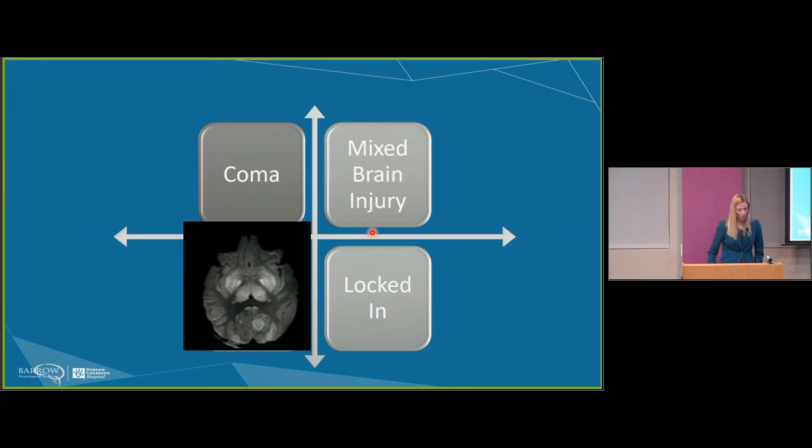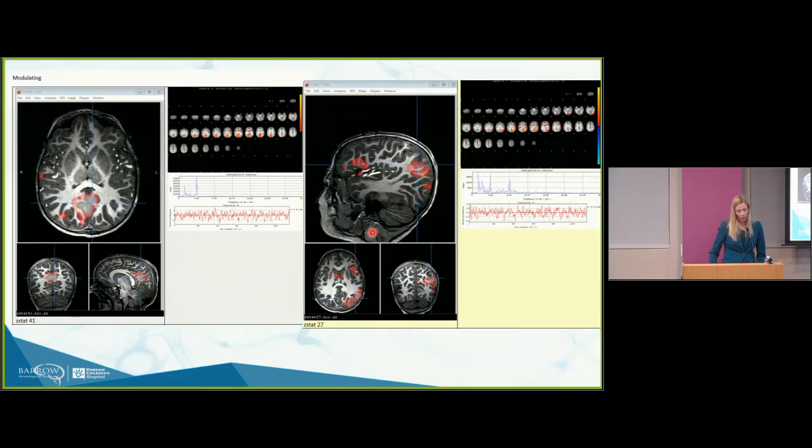And this individual was thought to be potentially brain dead or in a coma at the time of their resting state functional MRI. And the resting state functional MRI did show default mode network with normal time signal and also long-range networks. It was really tough for me to believe, even because of how bad the child looked at the bedside. This child did recover all brainstem reflexes and did recover consciousness and is awake.